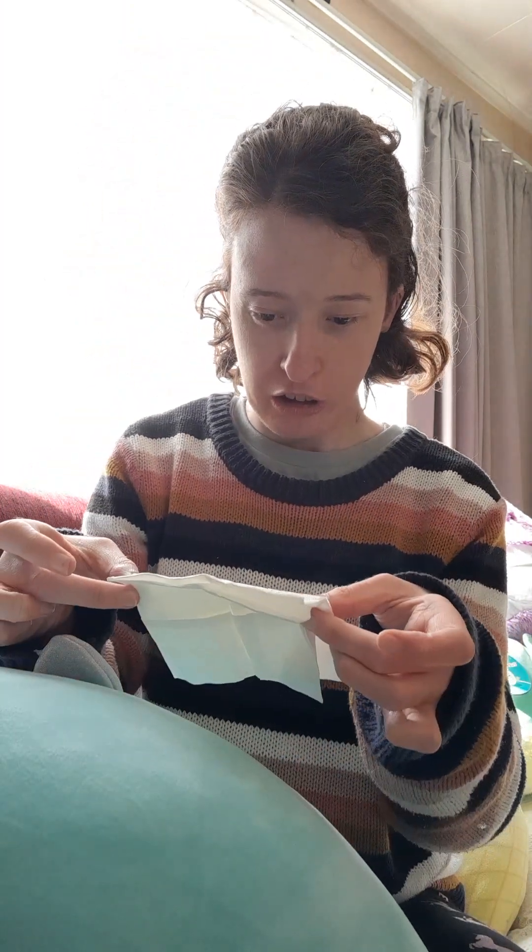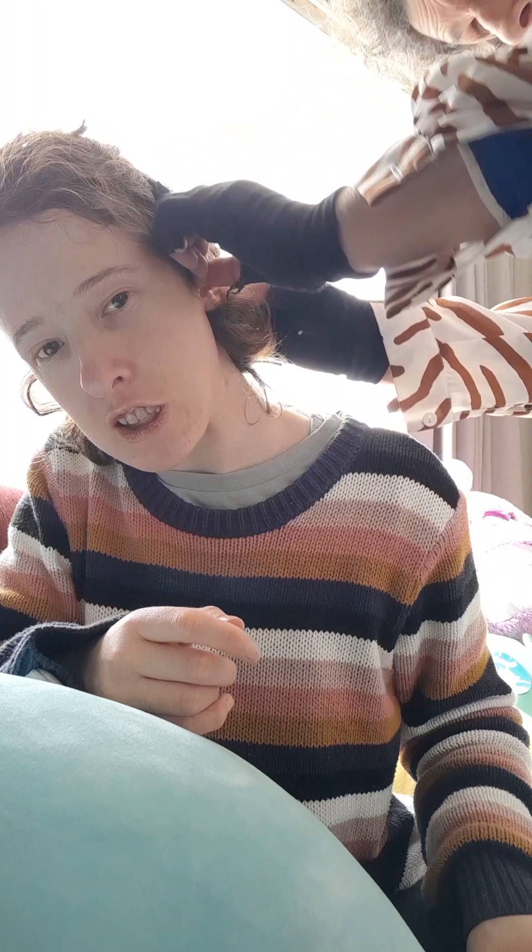Okay. No, no, I'm still going with my hearing aid. I don't know — should I? I'm still learning. Can you check it? I'm still learning. Mum is coming through so that she can pull it. Yeah, there we go — right, that's it. I will have to change the right ear plug.